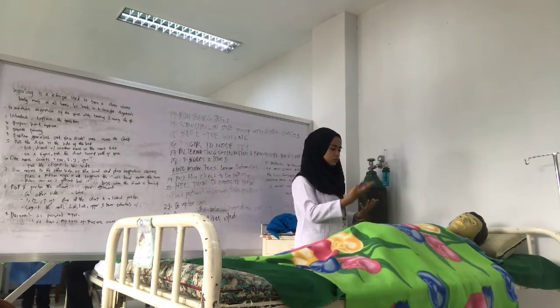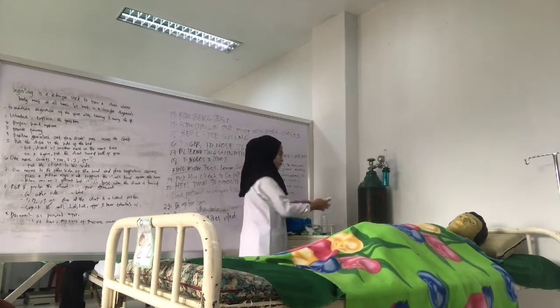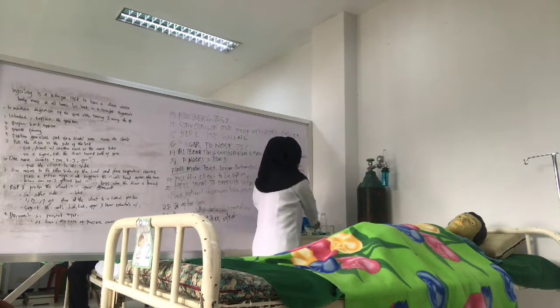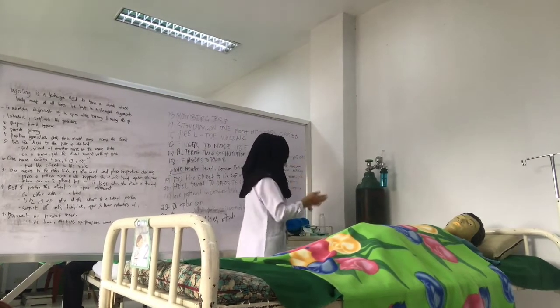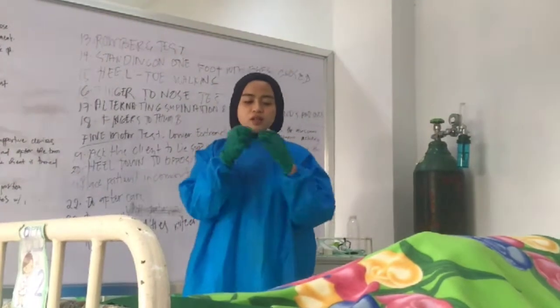Explain to the client the purpose of procedure. This is to reduce patient's anxiety. Perform hand hygiene and put on PPE if indicated. This is to prevent spread of microorganisms. Provide client privacy if appropriate. This is to promote comfort.